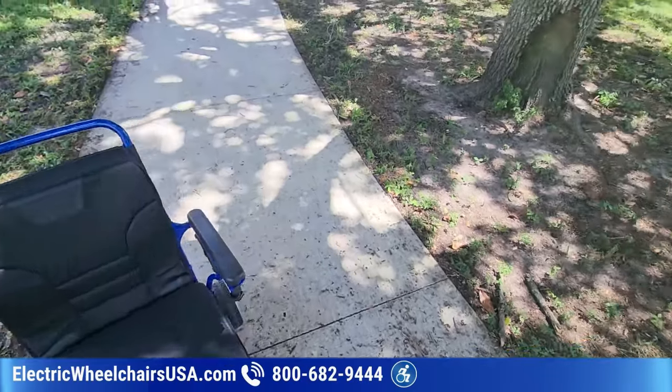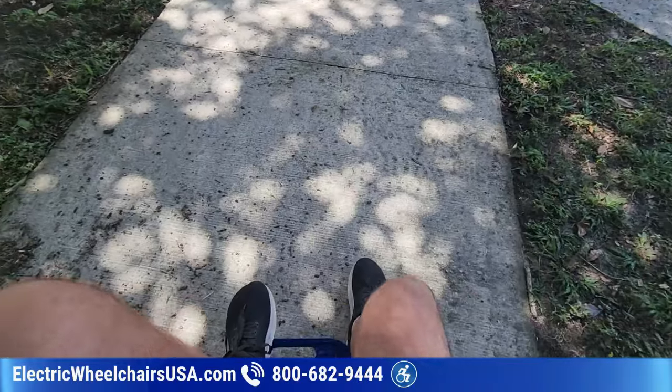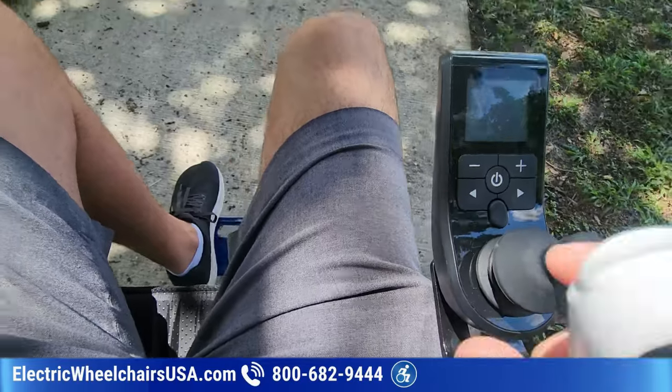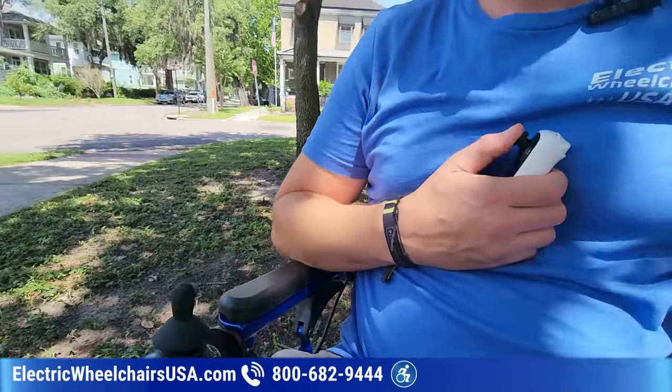If you're the type of person that has a medical condition where you cannot use the joystick, you can hold this in your hand. So say your arm, you have a hard time controlling this, you can use your hand, just kind of put it against your chest. You can operate it this way.